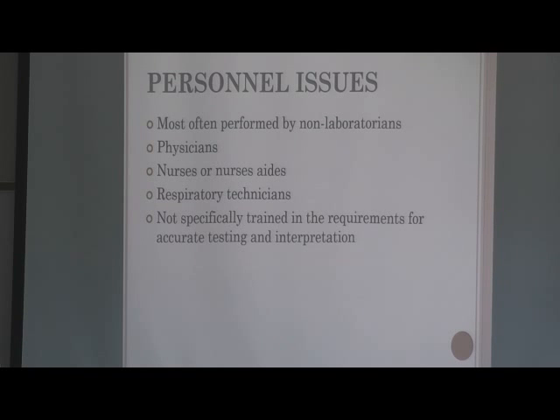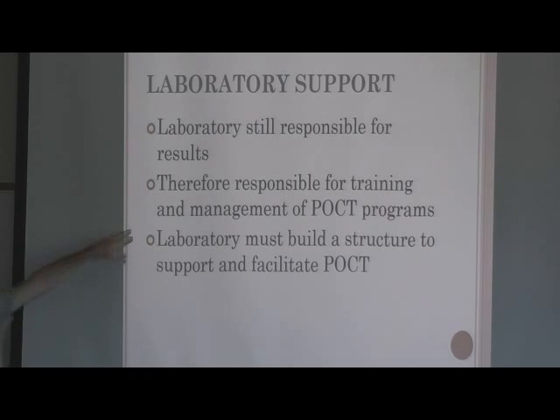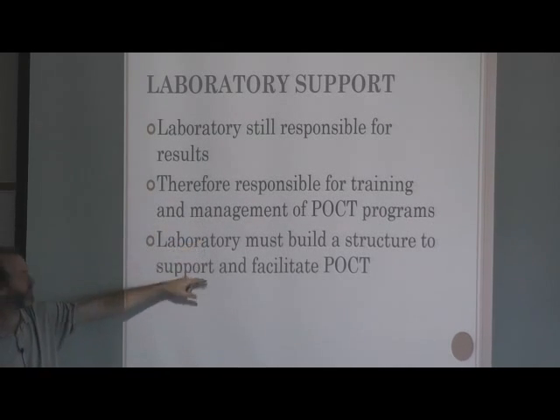So there has to be somebody designated from the lab as being in charge of point-of-care testing, and then they have to be in charge of training everybody that does the point-of-care testing on the proper way to collect specimens and do the quality control and everything, right? Does that make sense? And then they have to do recurring training and keep the machines up to date. So it's most often performed by non-laboratorians: physicians, nurses, nurse aides, respiratory technicians, not specifically trained in the requirements of accurate testing and interpretation. But the laboratory is still responsible for results, so they're responsible for the training and management of the point-of-care testing programs.